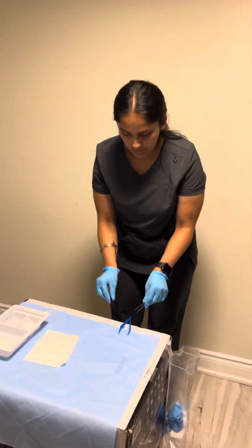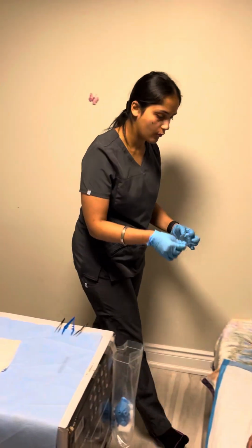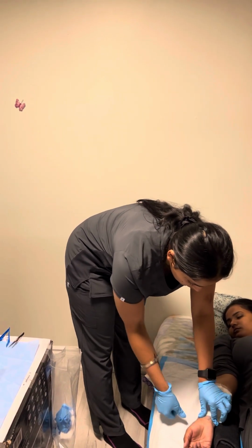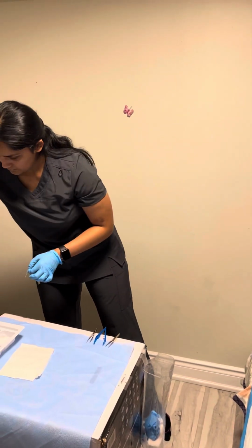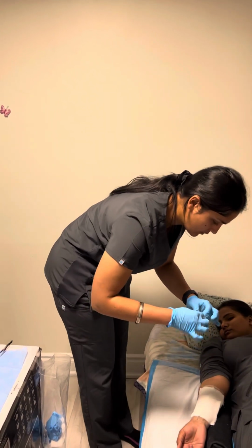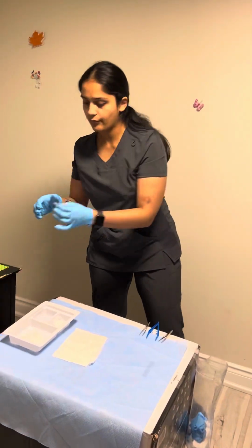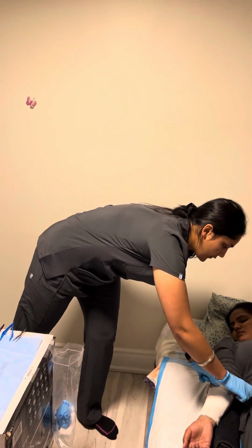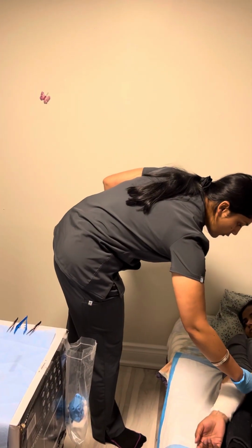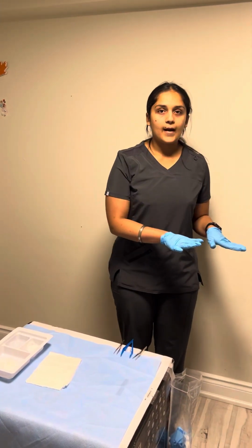Okay, now I'm going to put the forceps within a 1 inch border, and I'm going to fix the dressing with the help of bandages. 1, 2, 3, and 4, and the last one is for the documentation of date and time, and I'm going to document the date and time with my name and initials. Okay, so I'm done with her dressing.